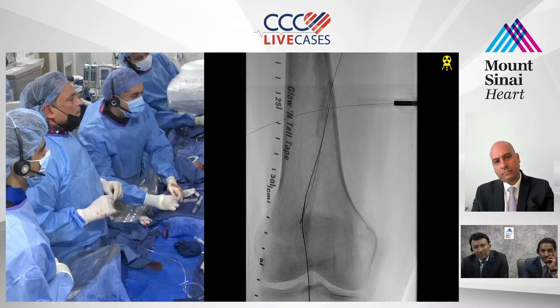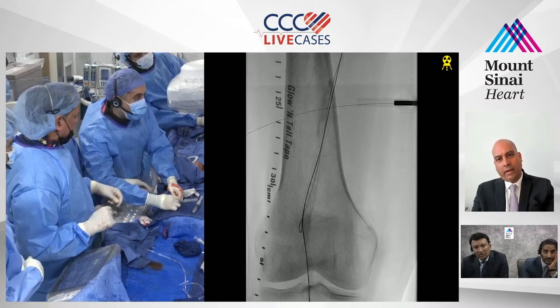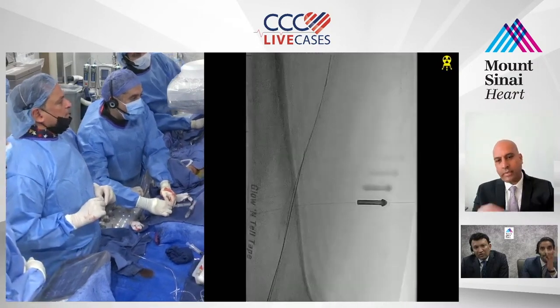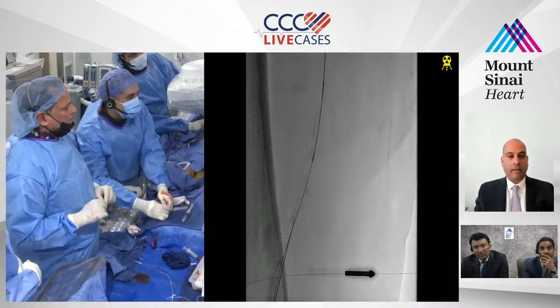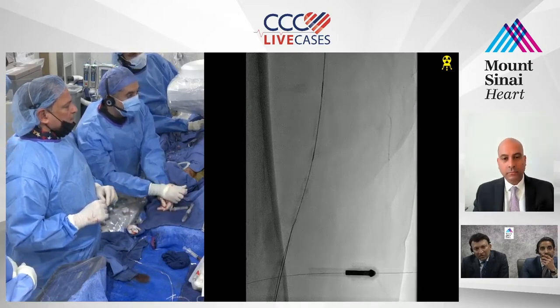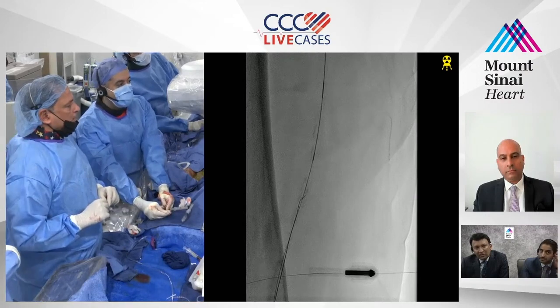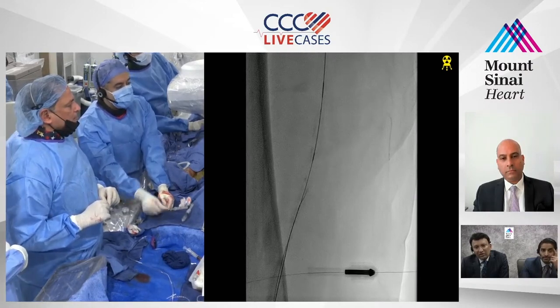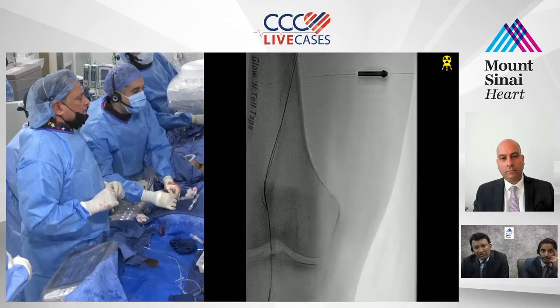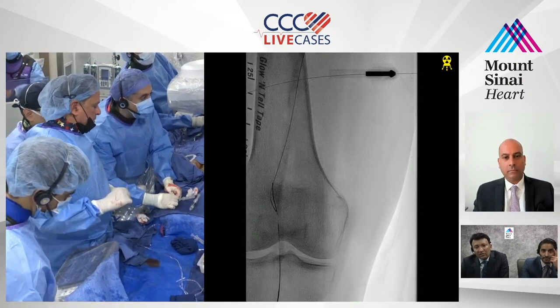In the wire? What do you mean? You're talking about the access? One second, just stop for a second. Here, look. I want to see. Okay, let's see if we can get in here. Nope, PK, it popped. I think it popped in distally. I'm saying you can get into the catheter distally. So just look at the calcium distally. You think I can't transmit my force.